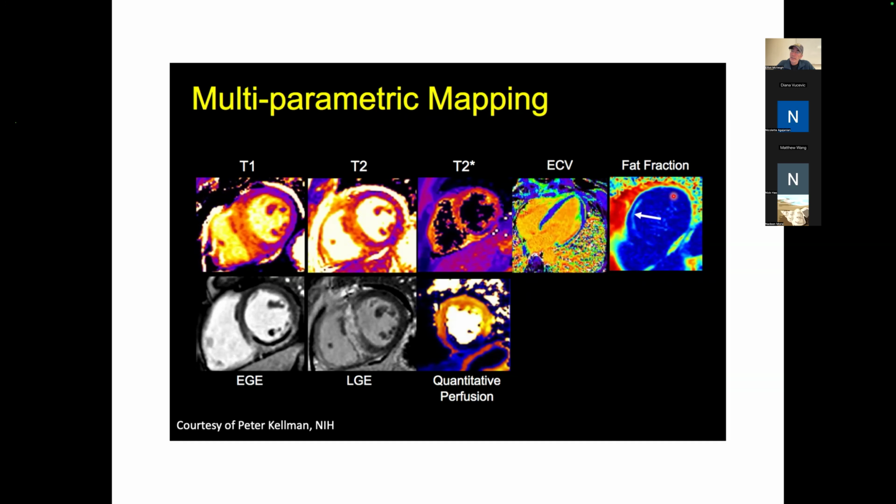You can evaluate, because fat atoms, basically the hydrogen in fat resonates at a slightly different frequency than the hydrogen in water. You can isolate the fat and the water signals when you're doing proton NMR. And here you've got some buildup of fat in the tissue, right? Which is essentially a specific disease.